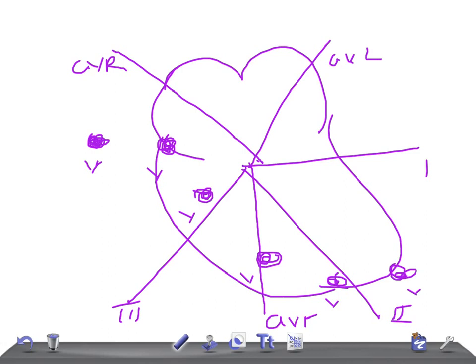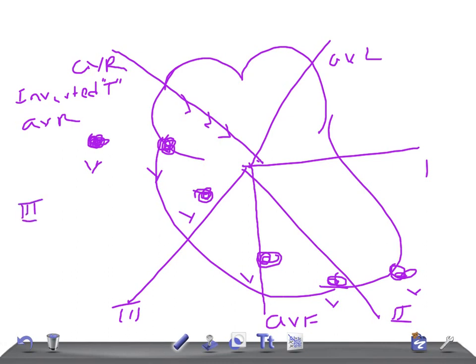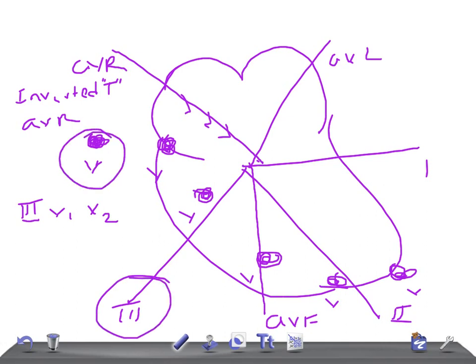It is normal for the T wave to be inverted in AVR, because the current is flowing in that direction. So inverted T wave in AVR is a normal variation. In some cases, T wave inversion can also be normal in leads 3, V1, V2, and V3.